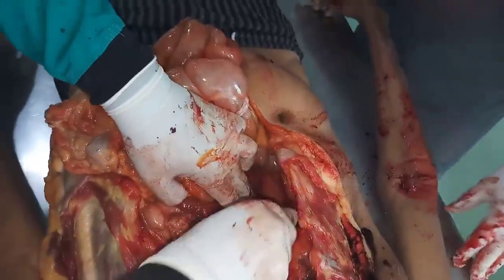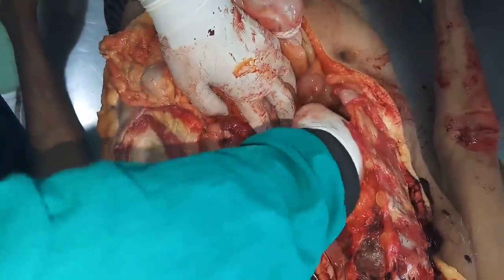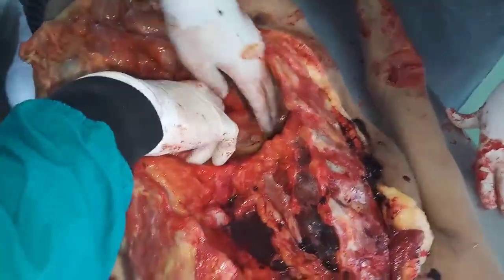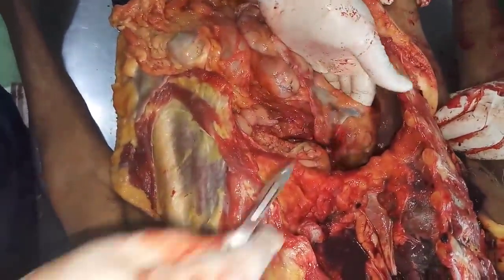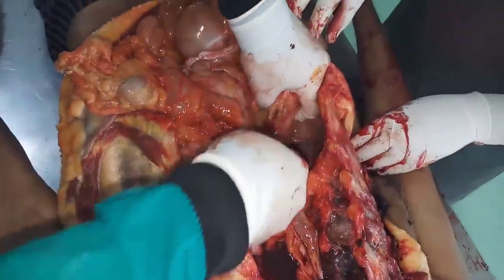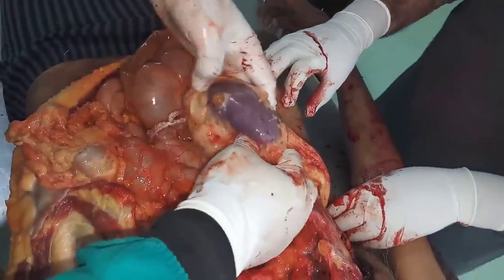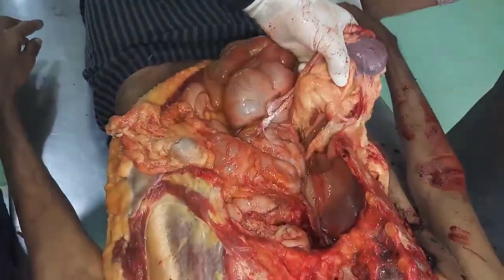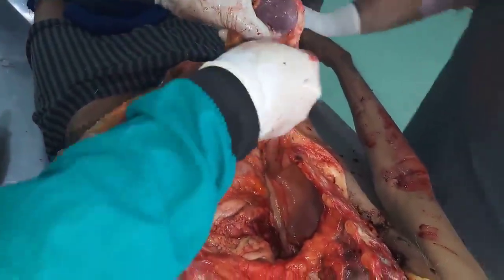See kidneys. I'm just giving an incision in the retroperitoneal area and trying to find out the kidneys. So these kidneys are there. So you can see the kidney, some cysts over the surface of the kidney. Multiple small cysts are also there on the surface.